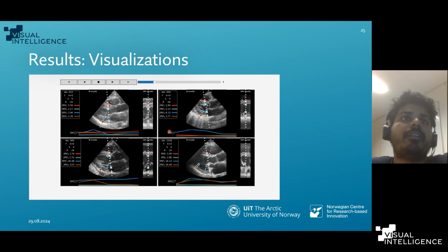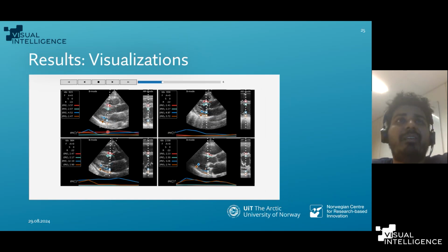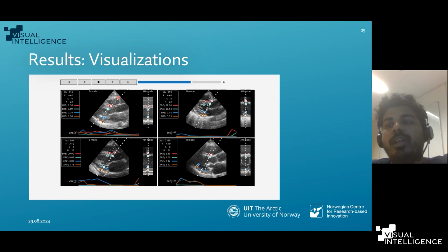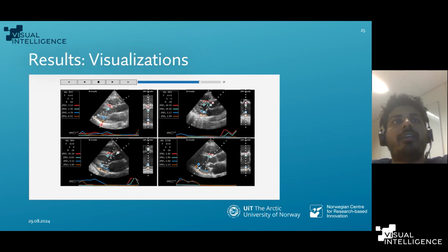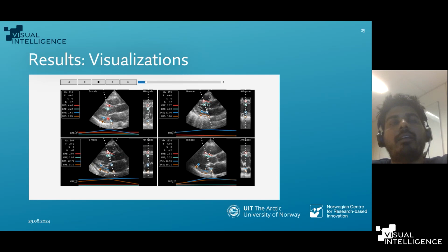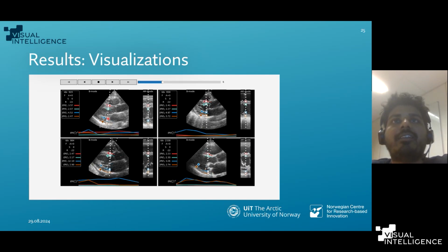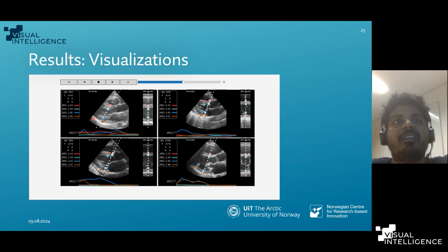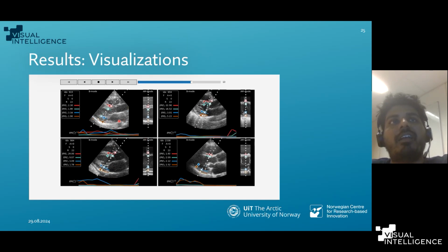Here in this animation, I am doing some uncertainty based analysis. The idea is that if the rotation is too large, I should get high uncertainty for that particular point, and if the rotation is small, I should get low uncertainty. But I must admit that these are some nice looking images. Sometimes different structures in the left ventricle are barely visible to the eye.